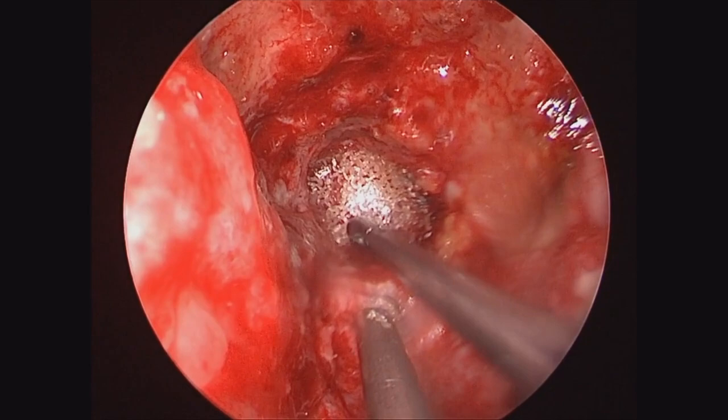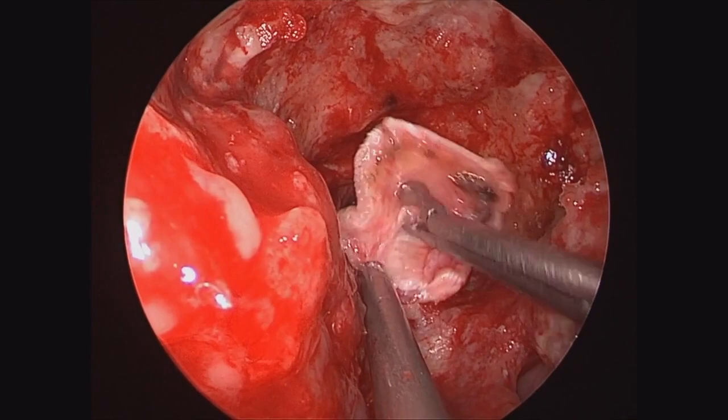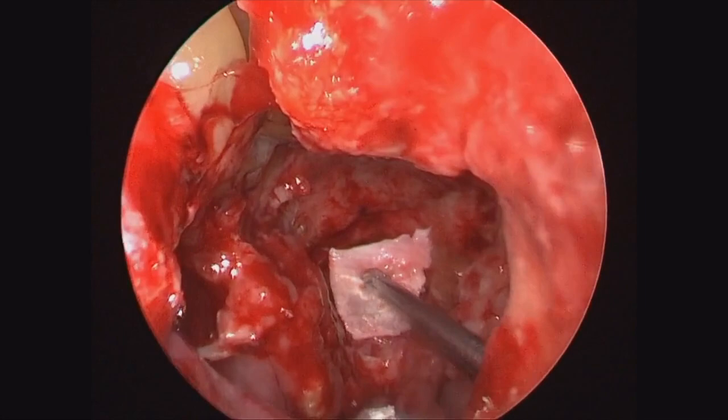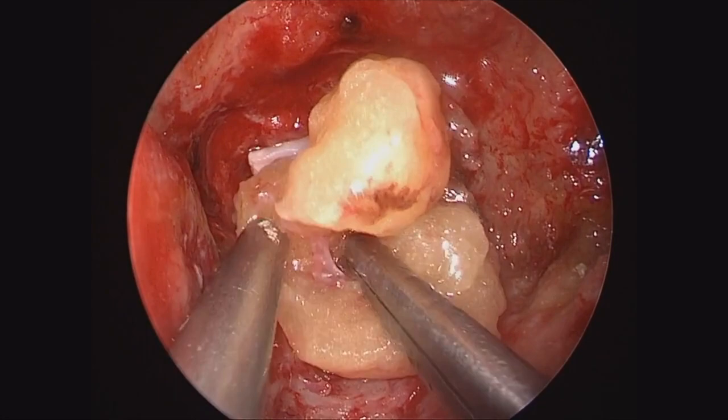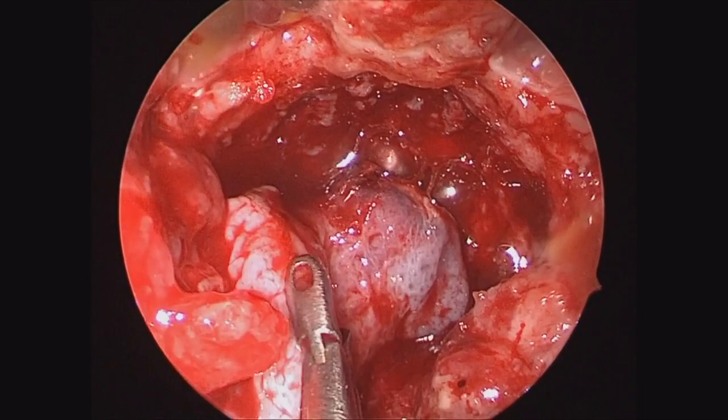It's important to make sure that the fascia lata is completely unfurled on the intradural side. Then we went ahead and placed a little bit of Surgicel, followed by a fascia lata onlay, which adds extra stability to the reconstruction and gives you a nice hearty layer on the nasal side of the dural defect. We did that in two layers, followed by a fat graft. That does a number of things, including helping prevent CSF leak, as well as helping to prevent an encephalocele postoperatively.